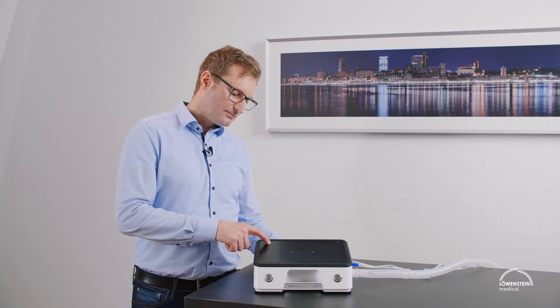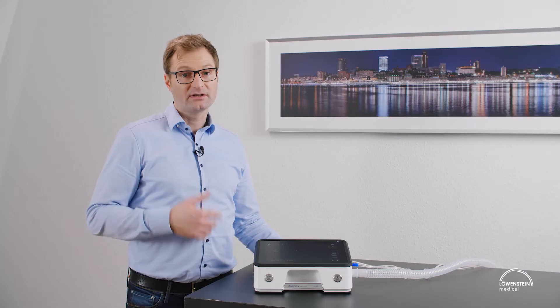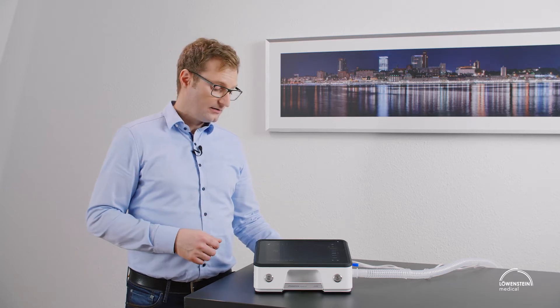To unlock the device, we press the lock button for three seconds and now we are in the expert menu and can adjust or set the device.